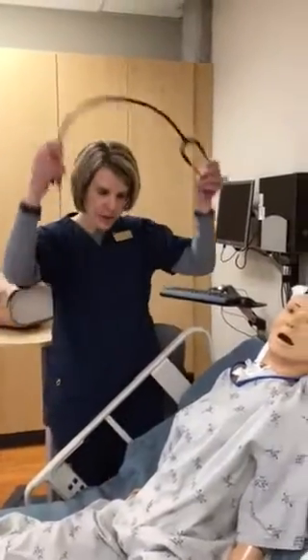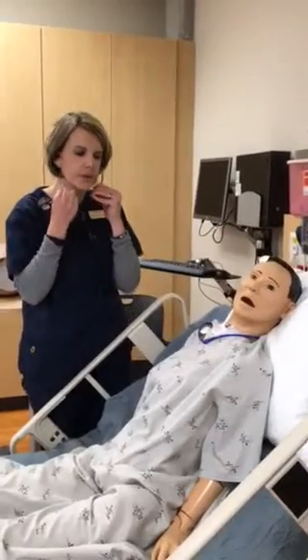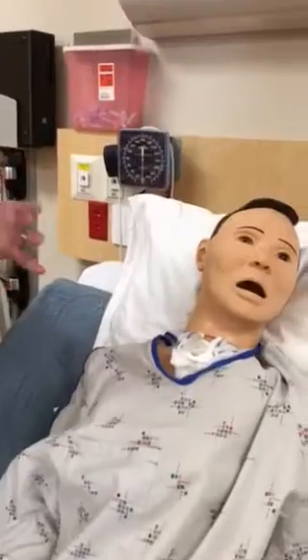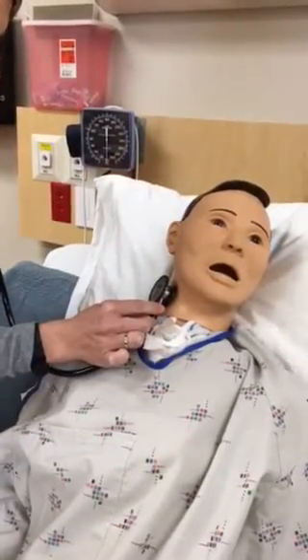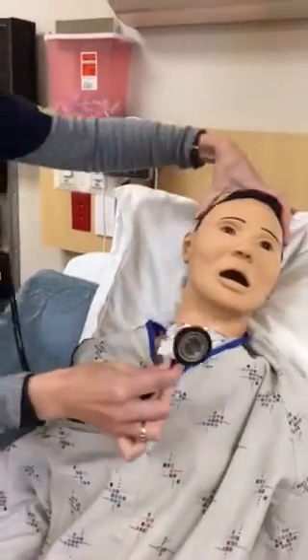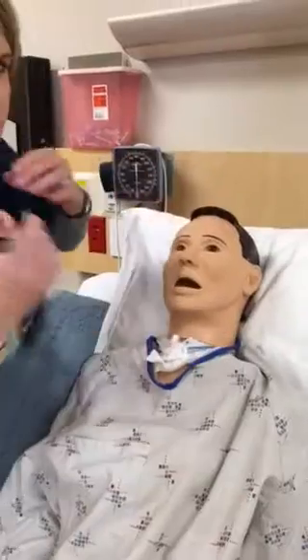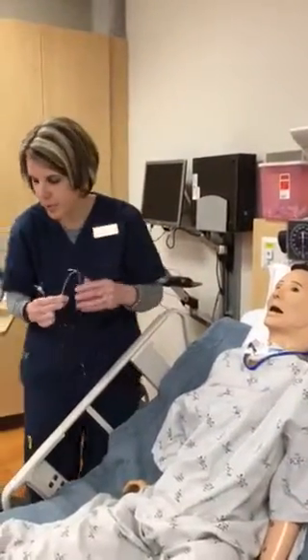Next, since we're here in the neck, we're going to listen to the carotids. And remember, you're going to use the bell of your stethoscope. I always test it first. And remember, you shouldn't hear anything, okay? But we're listening for a bruit.